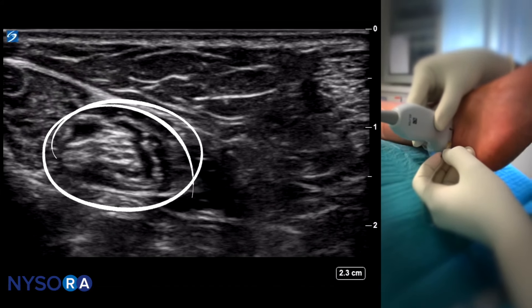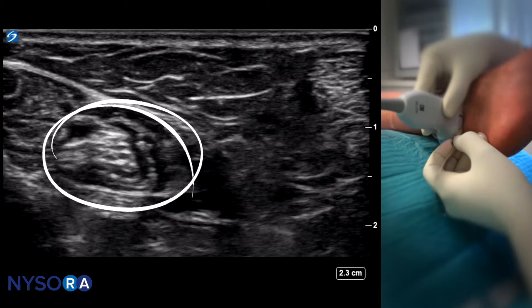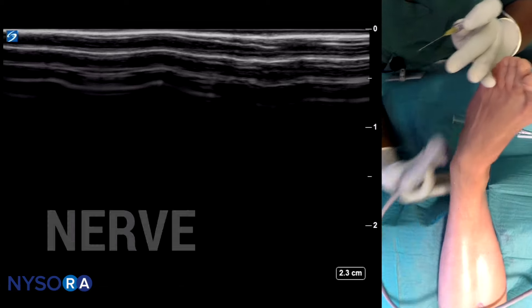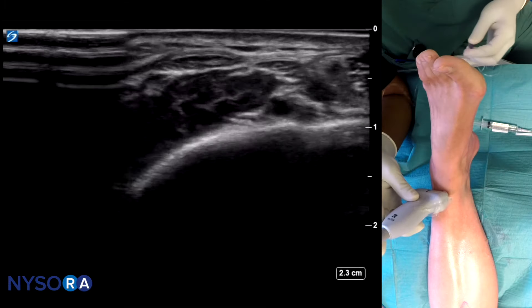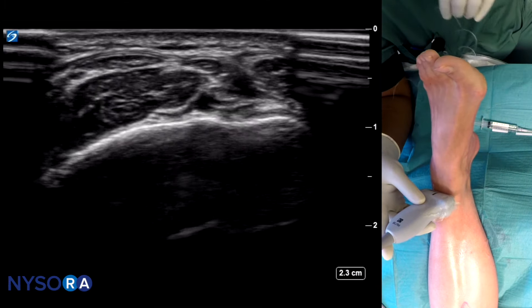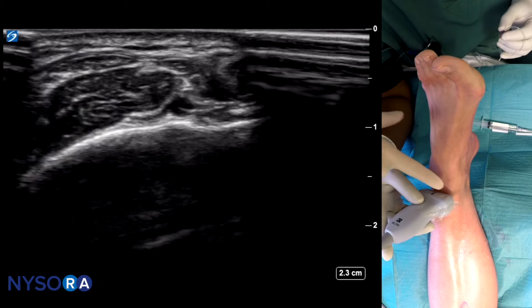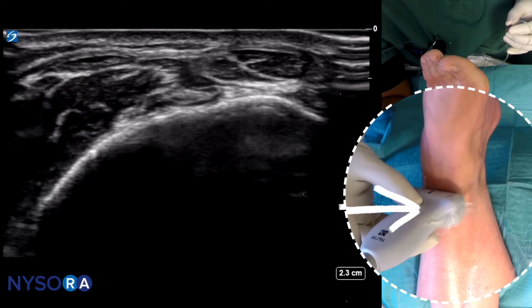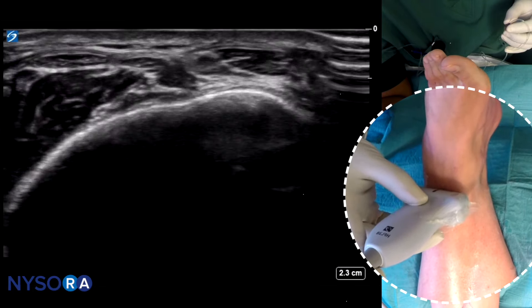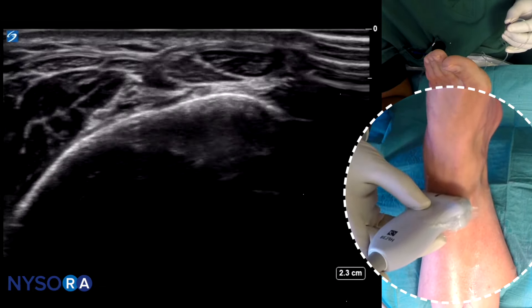The next nerve is the deep peroneal nerve. To get a good deep peroneal nerve image, it is crucially important not to apply excessive pressure. If you apply excessive pressure — as we will demonstrate right now — you can see how we obliterate the dorsalis pedis artery. Try again: press, and the artery tends to go away completely, making it almost impossible to visualize the main anatomical landmark, which is the artery itself.